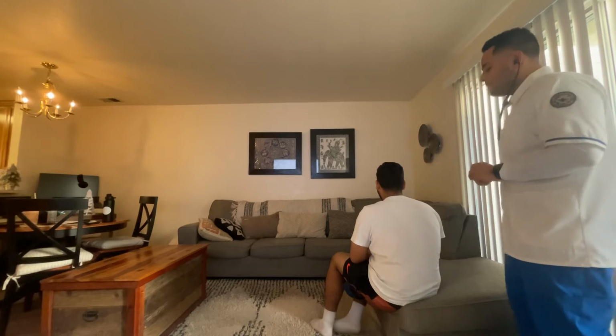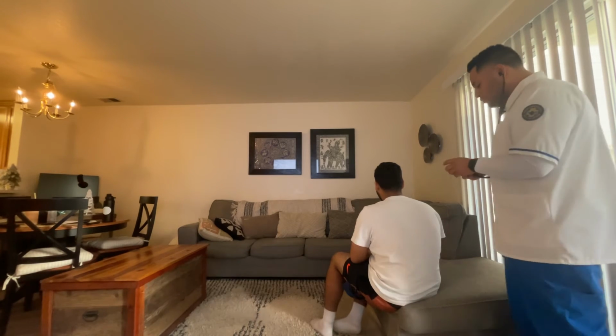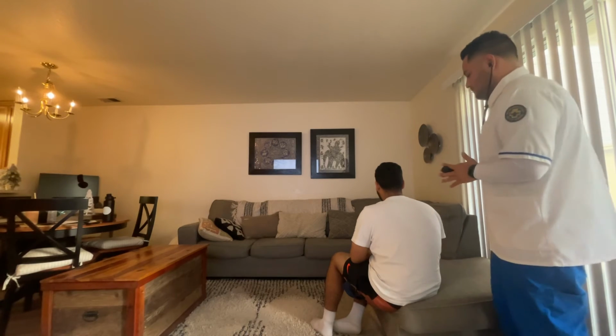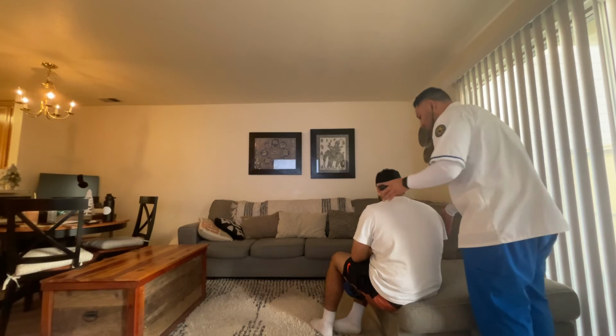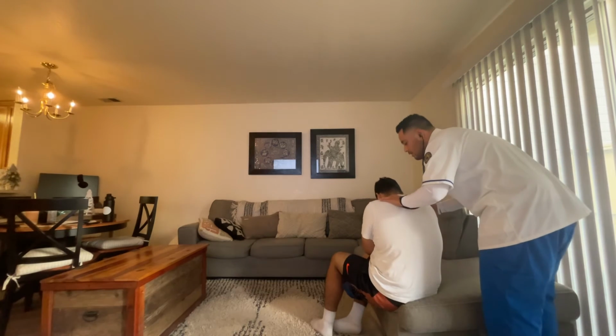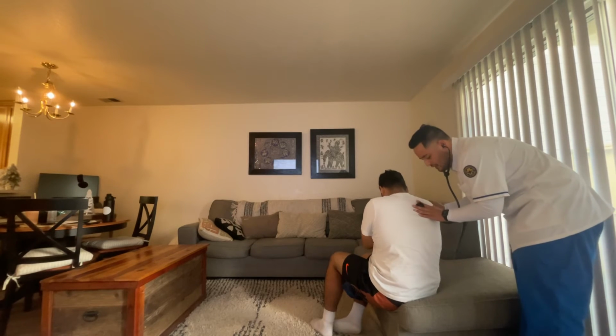I'm going to do 10 points on my patient, beginning with the apex of the lungs. So I'm going to start up here. Every time I touch, I'm going to ask you to take a deep breath. Could you cross your arms for me? Thank you. Go ahead and take a deep breath. Perfect. Deep breath. Clear and concise sounds. Come on over.